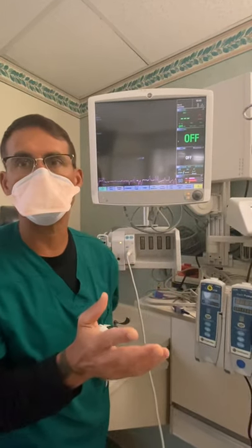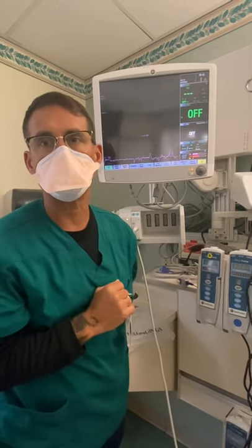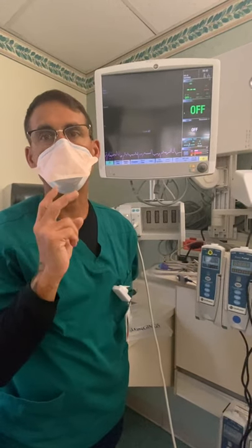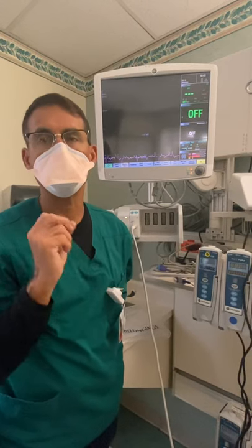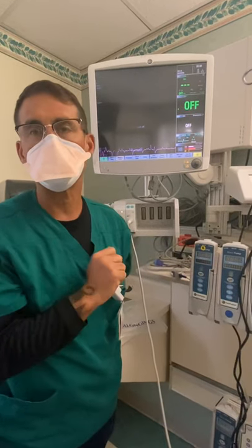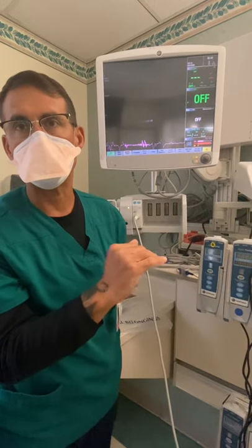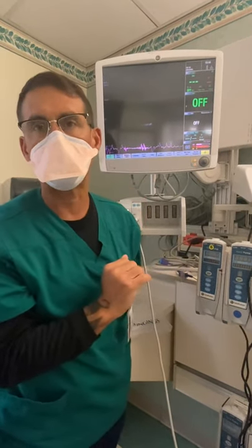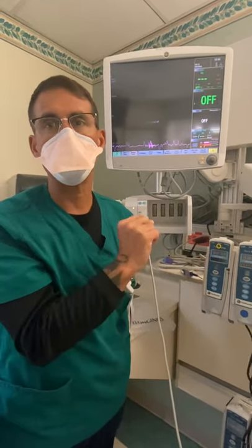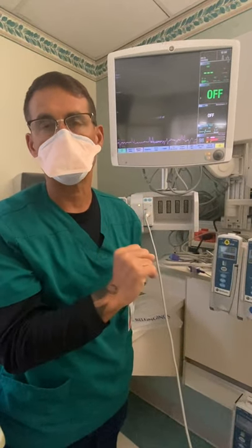Now, how often are you gonna do that? I don't want you in your room every 5 minutes trying to micromanage your BIS numbers. So you're gonna monitor this every 2 hours. That means that you will not make titrations to sedation more often than every 2 hours on paralyzed patients. You make your titration up or down and you wait 2 hours. Even if they fall out of range in the middle of the 2 hours, or even if they go in range in the middle of the 2 hours, you're not gonna touch your sedation again. Only every 2 hours are you gonna come assess, look at your number, titrate up or down. And again, do not touch your sedation if you're within the range.